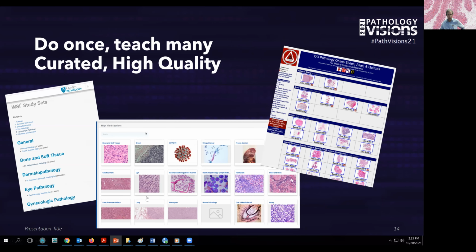Other ways of doing this, of course, are creating teaching sets, such as the DAPA high yield cases. That's one example. Here's another example from the OU files, teaching files launched by Dr. Fung, my colleague, and other institutions have similar files that can be made openly available. And the higher the quality here, the more robust, reliable the diagnoses, the more valuable, of course, the teaching experience. One nice feature about the DAPA files, of course, is that in general, they've been annotated by the individuals who are creating and curating these so that you have the opportunity to review them as an unknown or to review them with the annotations in various settings.